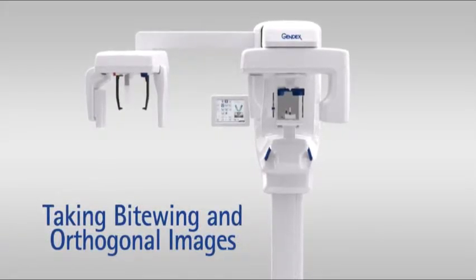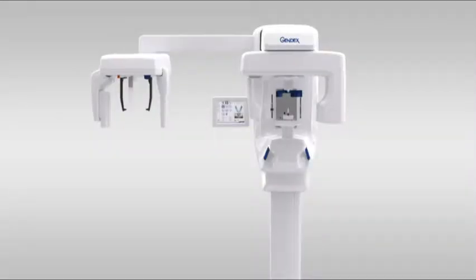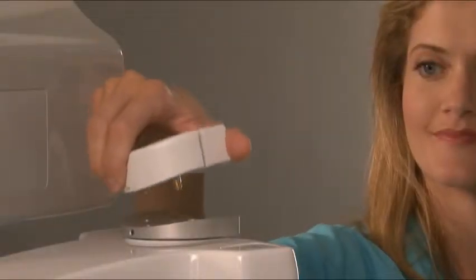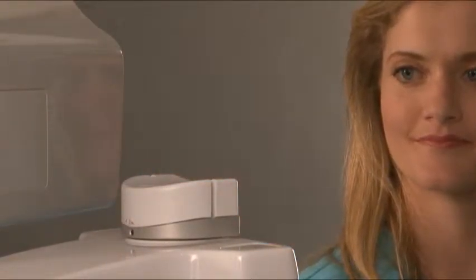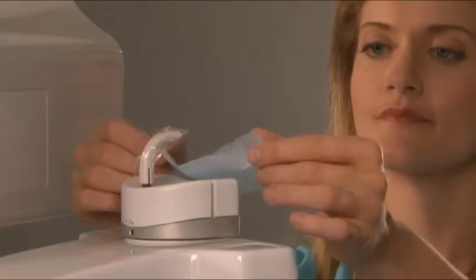Taking bitewing and orthogonal images. Set up the acquisition from within your imaging software. Press the patient positioning button to rotate the unit to the patient in position. Assemble the chin and sinus rests, choosing the appropriate configuration based on the image type being captured. Place the bite guide onto the bite rod, then place the bite guide rod assembly into the chin rest.